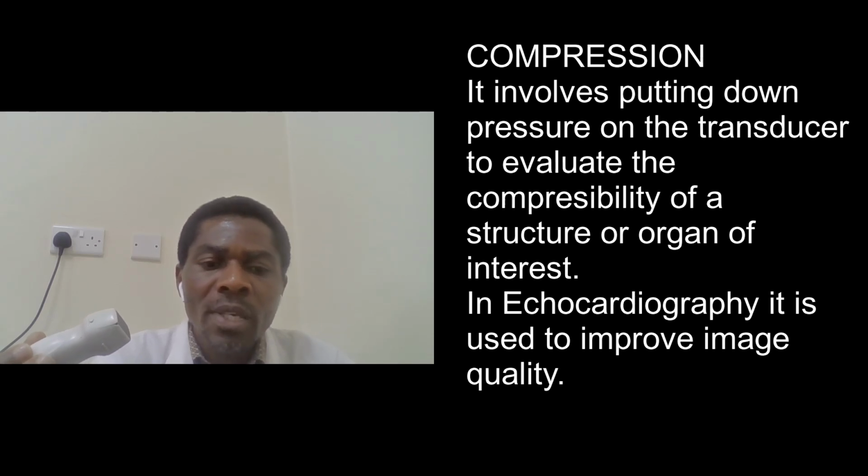Compression can also be used to differentiate between an artery and a vein. So usually a vein is compressible, whilst an artery is non-compressible.